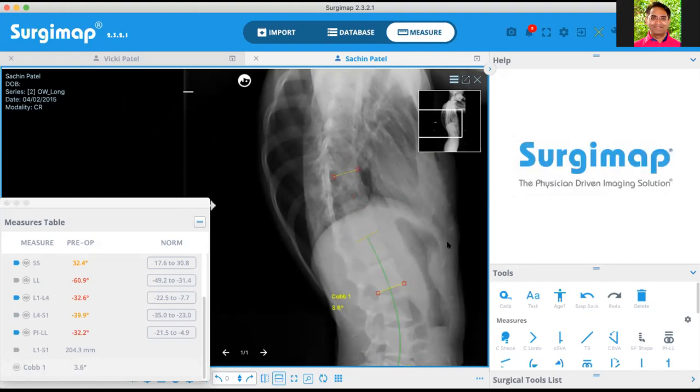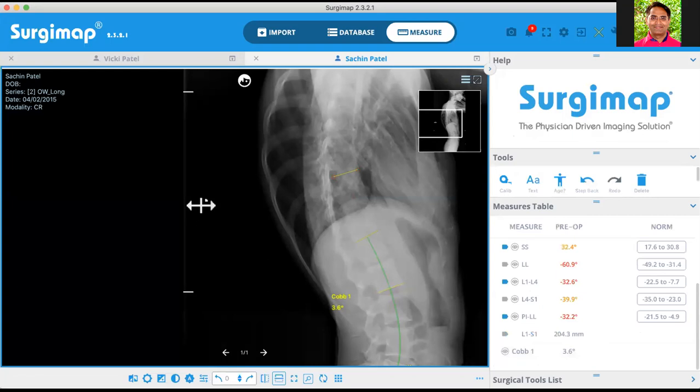I think now that perpendicular method is discarded almost, right? Yes. But if we are doing it on the X-ray, then we have to do it manually. We have to do it that way only, provided basically the lines go out of the X-rays. Yes, exactly. But I think most of the time they will, because the side-to-side X-ray has very limited dimension, and we don't get those 100-degree curves all the time, where the lines will match very soon.